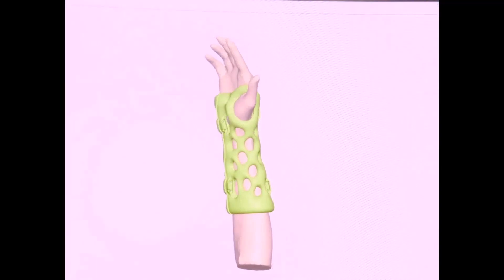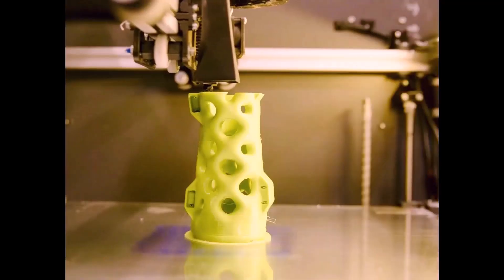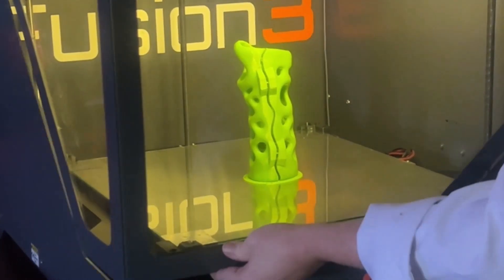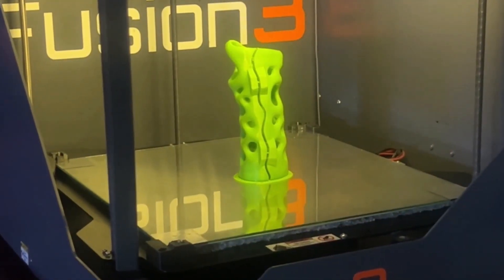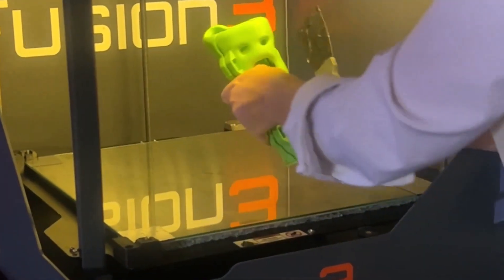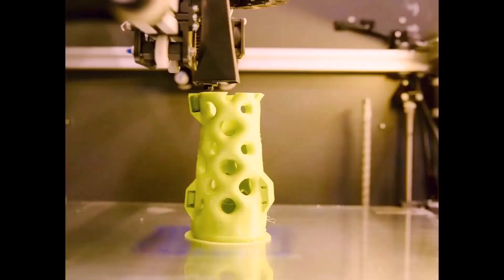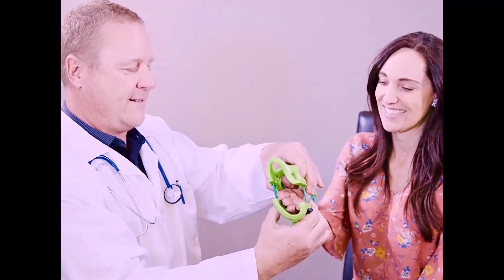The design files can be printed on any printer. You can utilize your existing equipment or order from one of our many fabrication centers across the country. We also offer a full turnkey package with printer that will fabricate custom wrist devices at point of care in around two and a half hours for a quick turnaround to the patient.